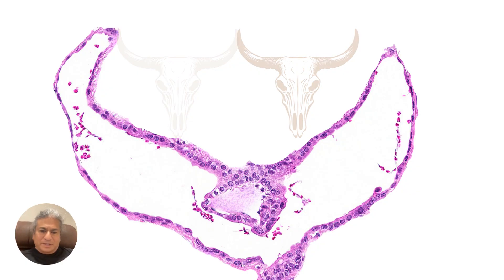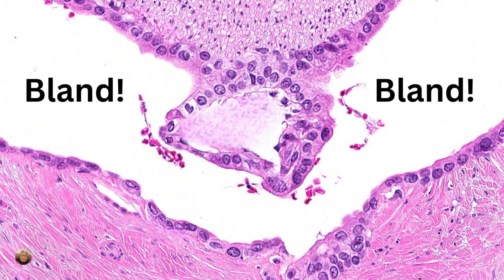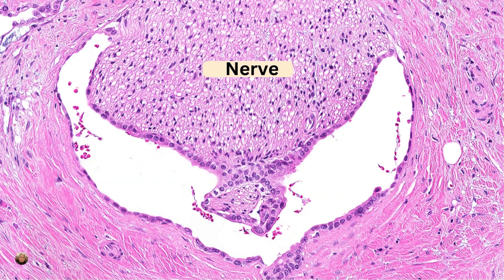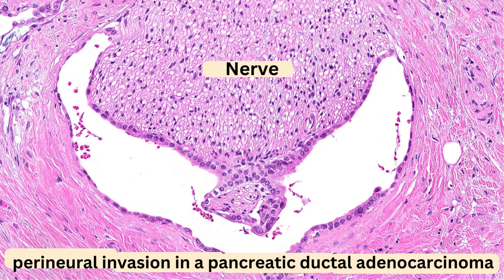Take a look at this on higher power. It looks extremely bland, doesn't it? There's no anisonucleosis, none of those irregular nuclear membranes that you often see with pancreatic ductal adenocarcinoma. But no — this is not benign. This is perineural invasion in a pancreatic ductal adenocarcinoma. By definition, perineural invasion is pancreatic ductal adenocarcinoma.